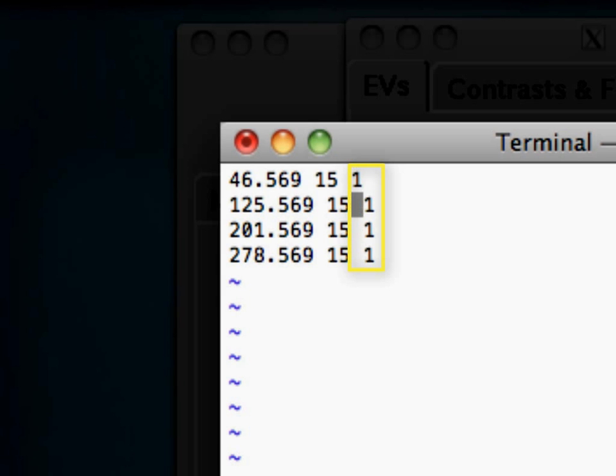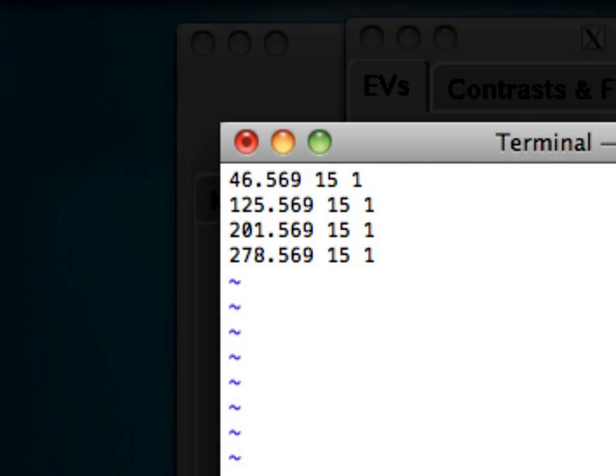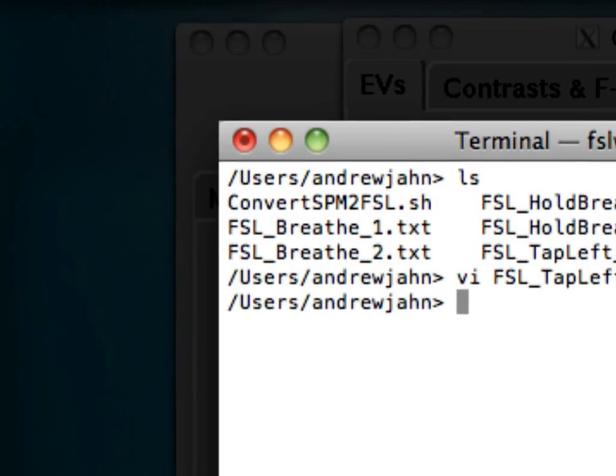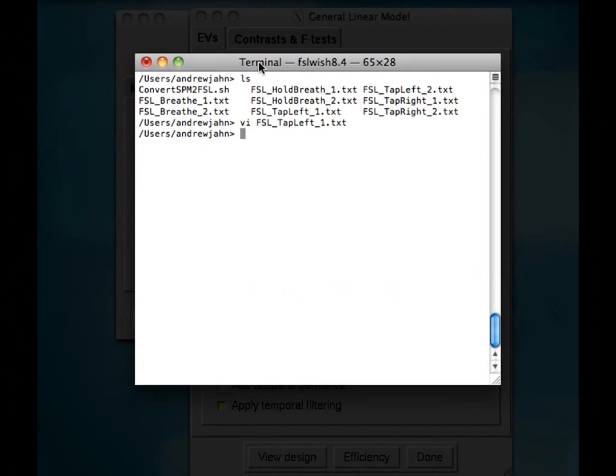So, for most purposes, if you have no reason to believe that there's any sort of parametric modulation within your conditions, you can just set this as one.